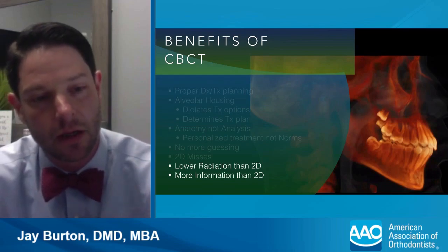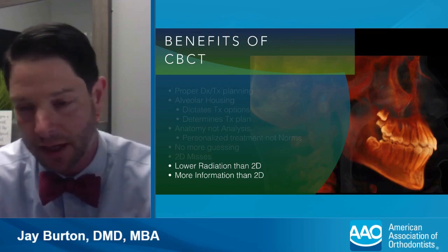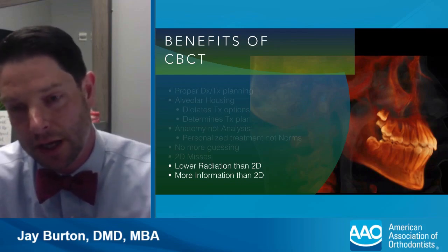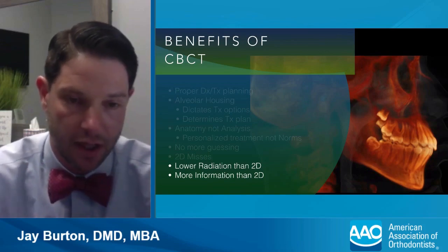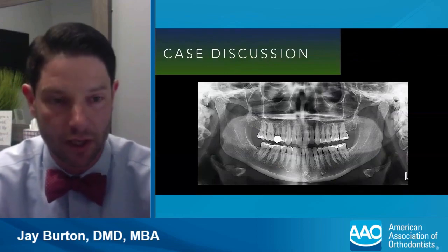And that really comes down to being able to diagnose and treatment plan properly. And at the end of the day, when you consider that it's less radiation than 2D radiography, and the amount of information you get is significantly more than 2D, it really is a no-brainer. So let's look at a case real quick.